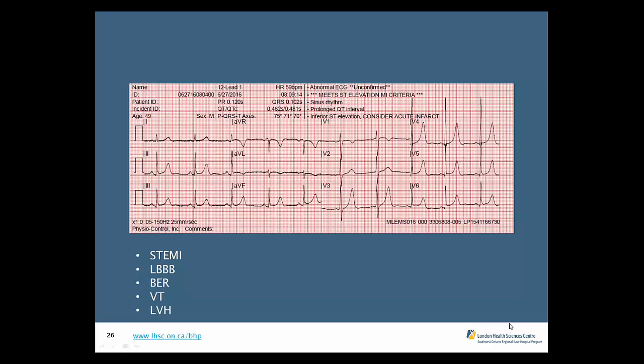As a paramedic, I would look at this ECG in the context of the patient in front of me. Depending on the story, if this guy has an ischemic type of story, and the computer says this is ST elevation, and your clinical judgment says this is a STEMI, then by all means get in contact with the PCI center, or implement your local bypass protocol. But there are features that go against this being a STEMI, and based on all of those features, this is actually benign early repolarization occurring. Thanks, Matt.